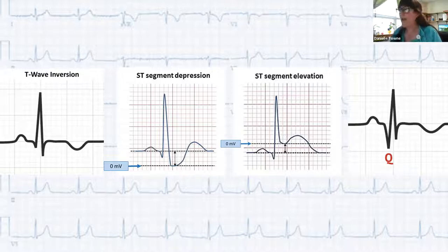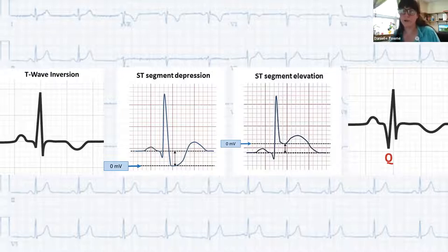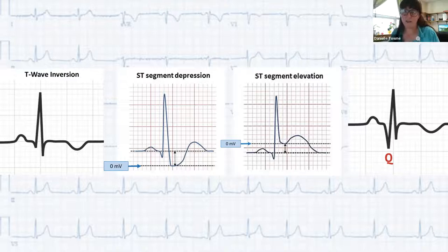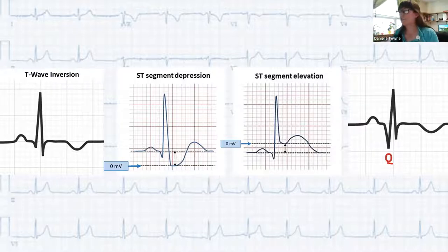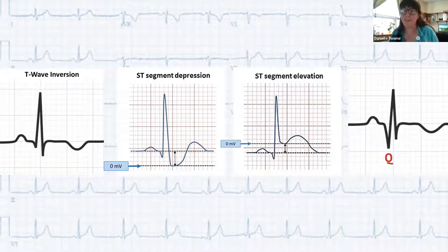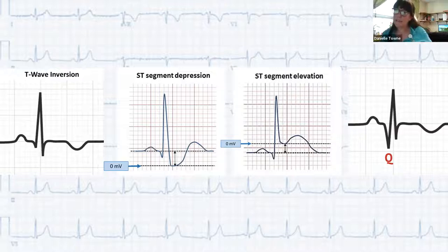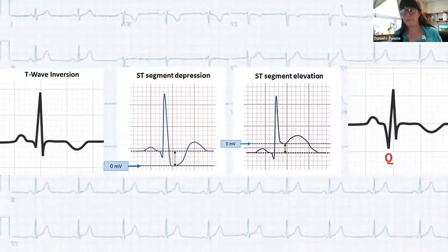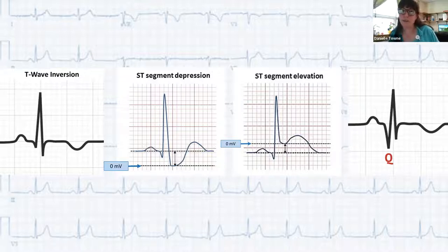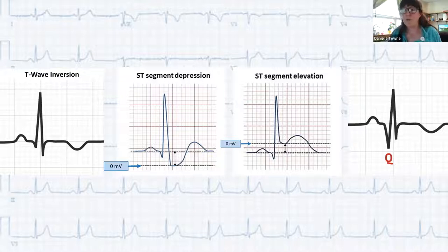ST elevation is generally a sign of more severe myocardial ischemia and injury — cells are actively dying or have died. There's progression of sodium-potassium concentration gradient dysfunction causing the elevated appearance. Infarction fully occurs when tissue death results from lack of oxygenation, and pathologic Q waves develop at that point — representing absence of electrical activity in an area. Pathologic Q waves take hours to days to develop but rarely go away once present. A Q wave is pathologic if its width is greater than or equal to one small box.